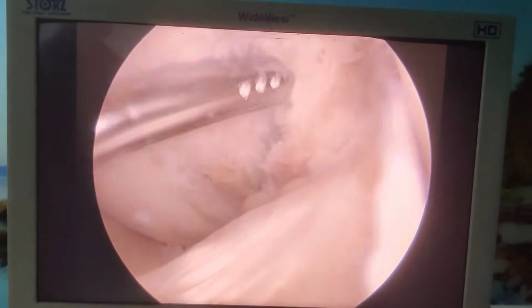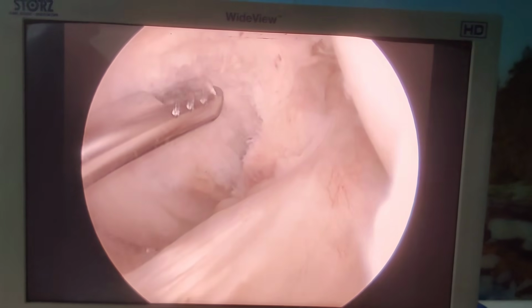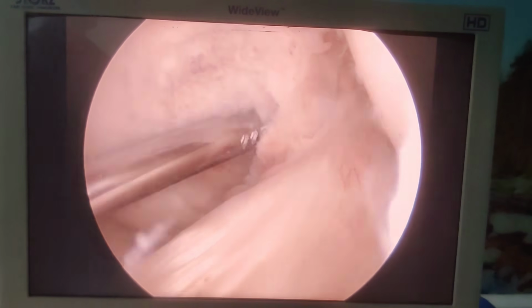So I've just used the shaver, I have debrided. This is where my anterolateral bundle will be. So it will be high up. I am just going to point it to you.